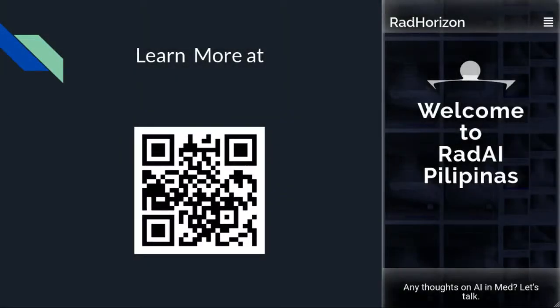So why did I build this app? Who is this web app for? Basically, I built it to help spread the word and inform more of my fellow radiologists about the potential use of AI in our specific practice.